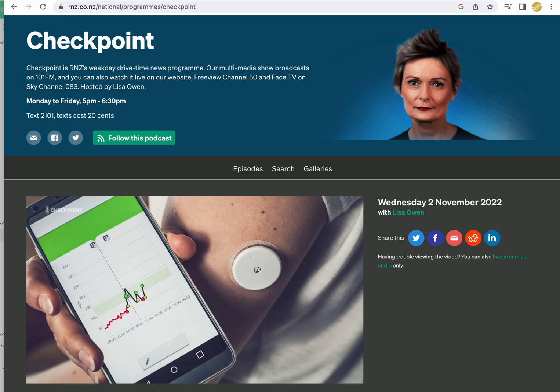There's alarms on there that make you aware that if your levels are trending in a direction within a certain amount of time, if you're going anywhere near that, within half an hour, your phone or whatever is going to make some noises. It gets quite annoying. It goes through your headset if you're in the plane, and then you can deal with it at the time.